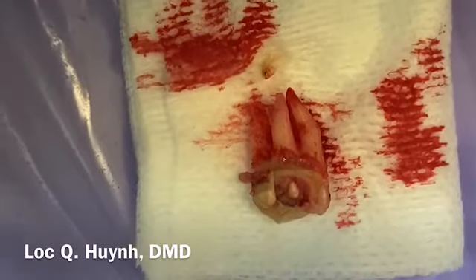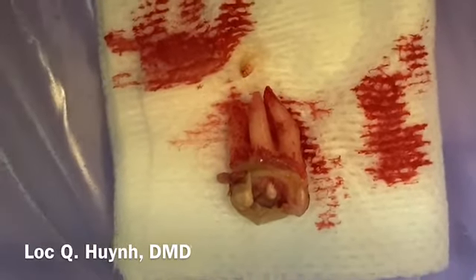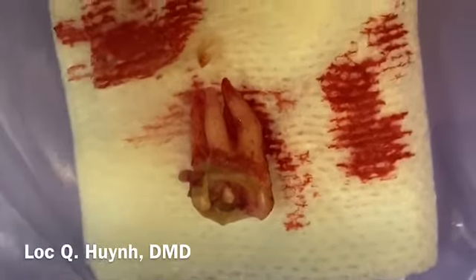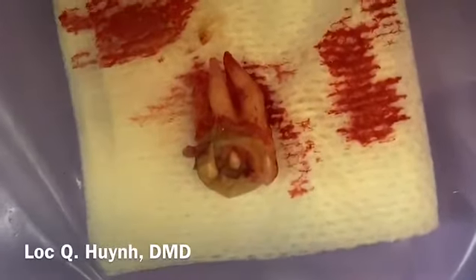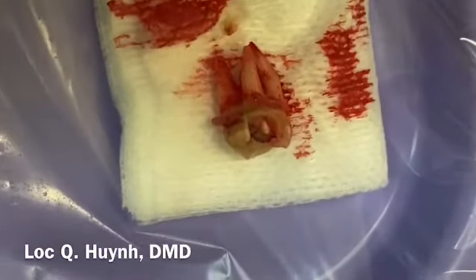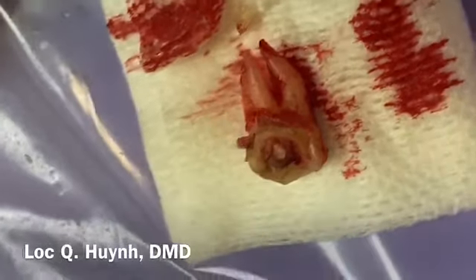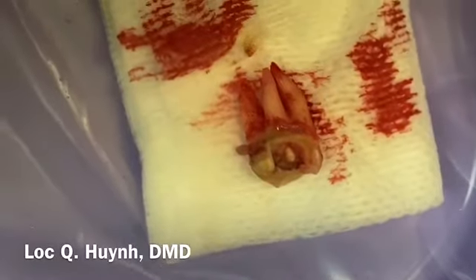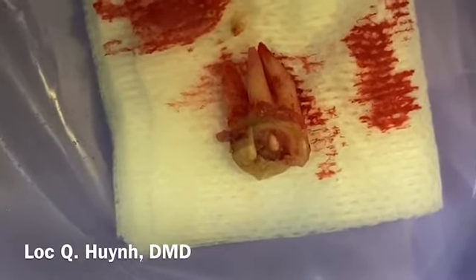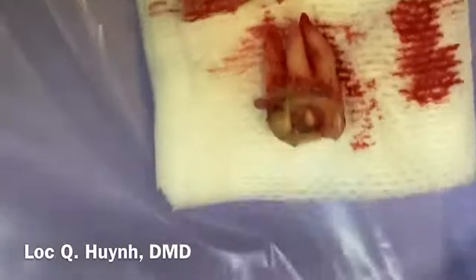So the way I handle this one is I would use an elevator to luxate the tooth until it is fully loose and erupt it occlusally, slowly. After you luxate enough with the elevator, you would use the 150 forceps, grab the tooth occlusally, and twist back and forth buccolingually, and it should come right out. And so that's how it works.